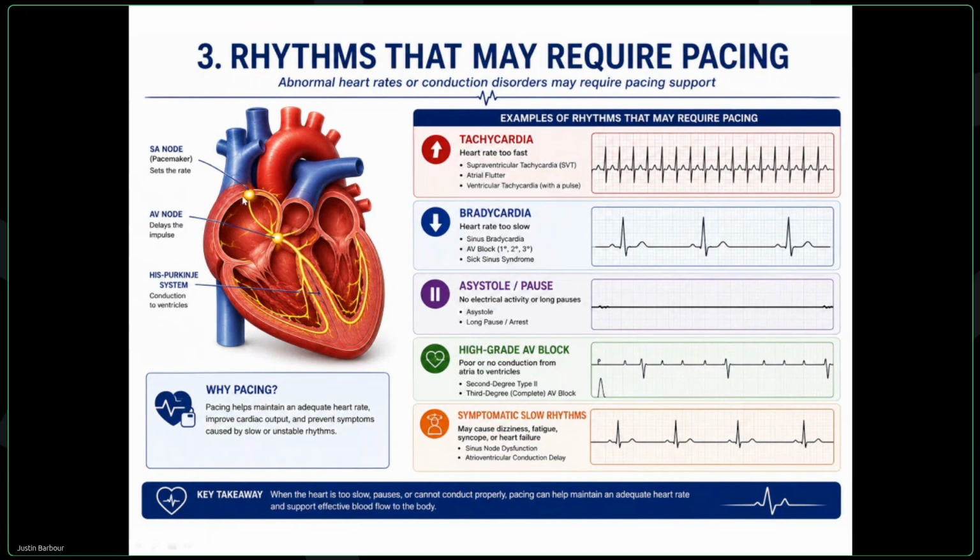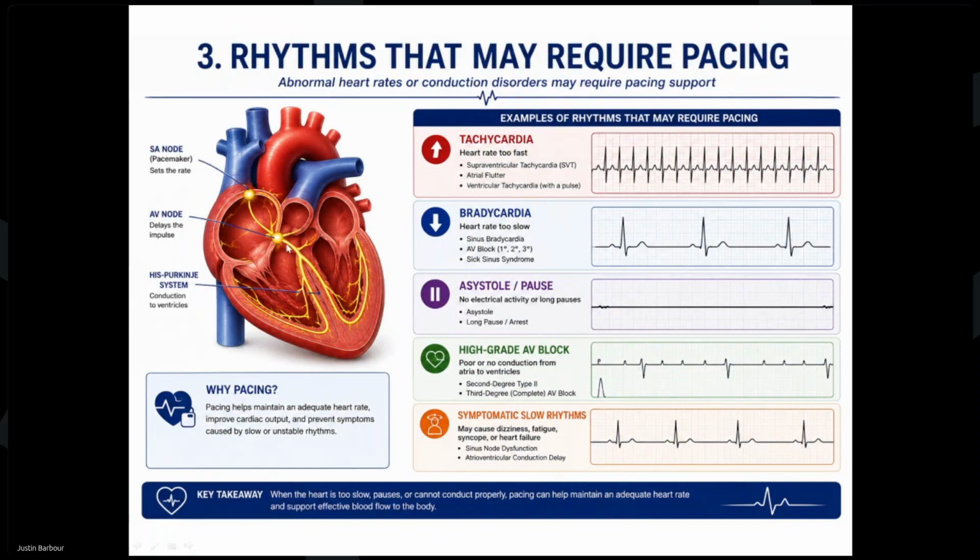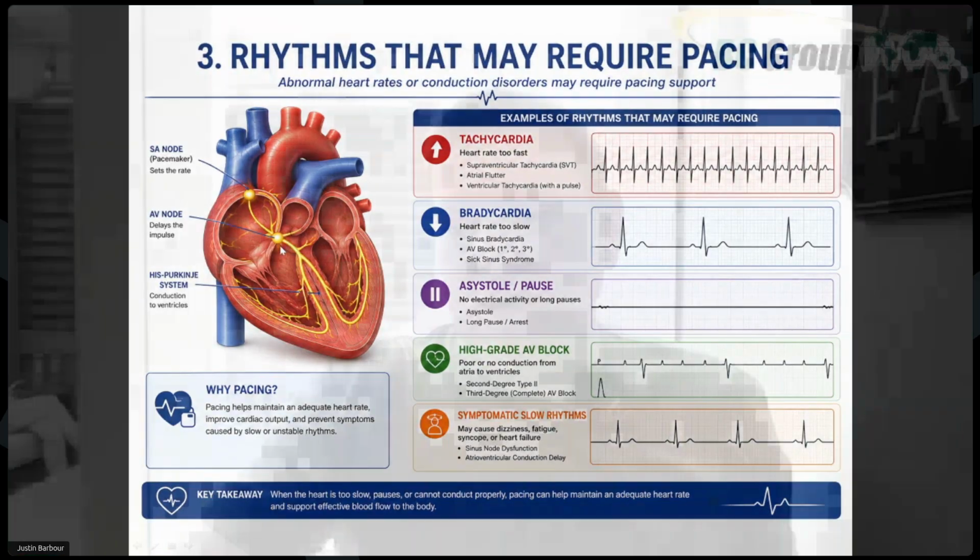Guys, these nodes right here, there's some excellent videos on YouTube, not even my videos. There's way better ones by cardiologists and neurologists that discuss this relationship between heart tissue and the nervous system. And imagine trying to design something like this guy right here that's simulating all that and taking measurements. What a precision measurement instrument. So just be aware that there's a lot of parameters it's trying to measure all at the same time, and it's super fast. It's in a split moment of a second.